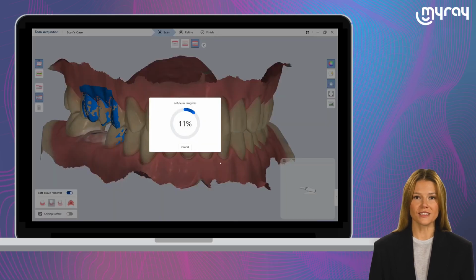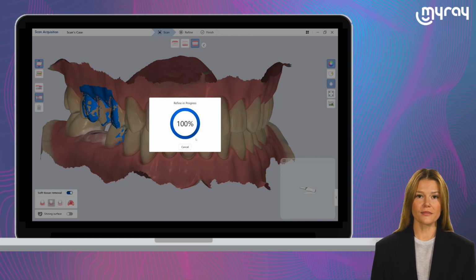It is recommended not to activate the device before being in the oral cavity and before the patient is closing, otherwise it is possible to record misaligned data. Once the acquisitions have been verified, we can proceed with finalizing the model.